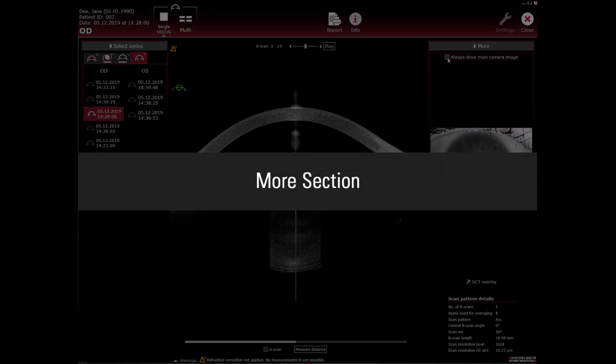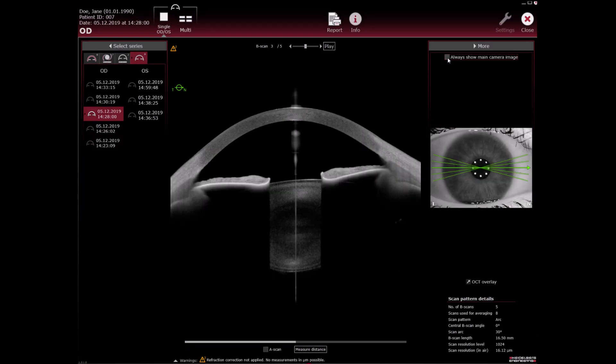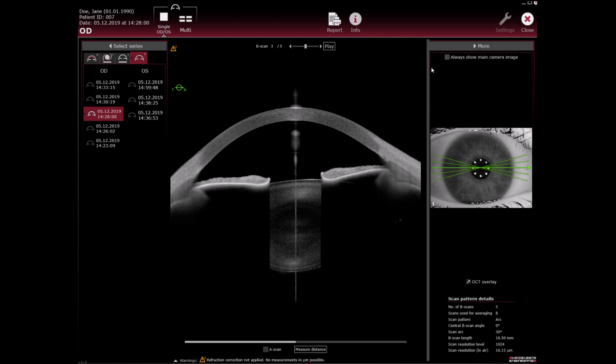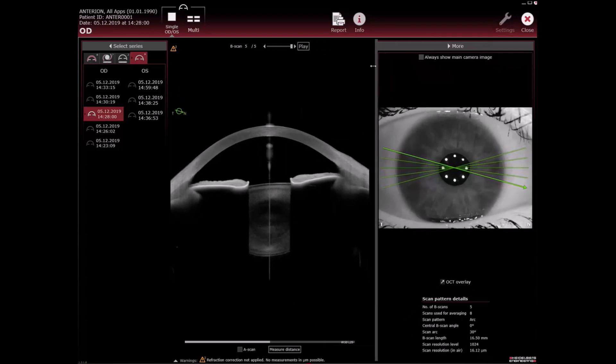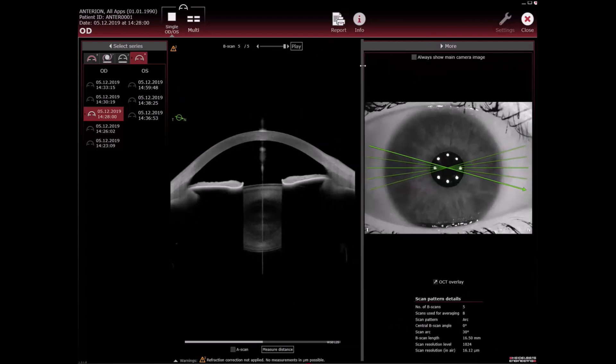More section: To change the size of the more section, hover with the mouse cursor over the border of the section until the mouse cursor switches to a double arrow symbol. Then drag and drop it to the desired size.